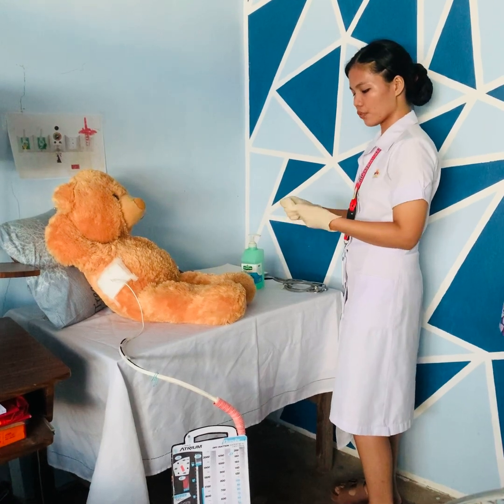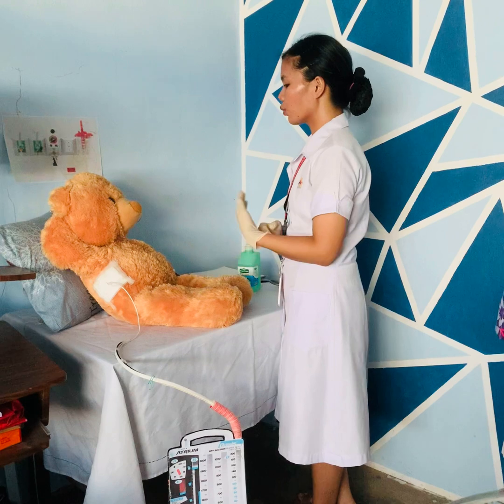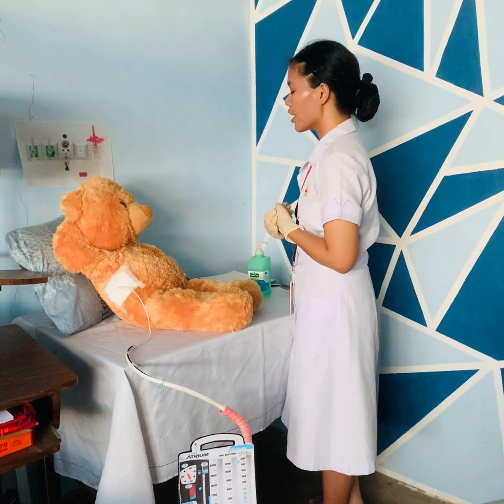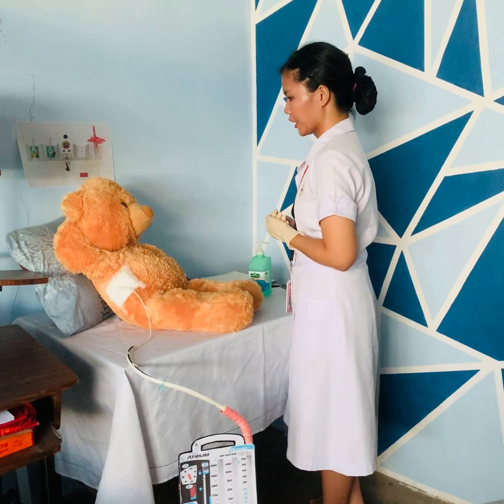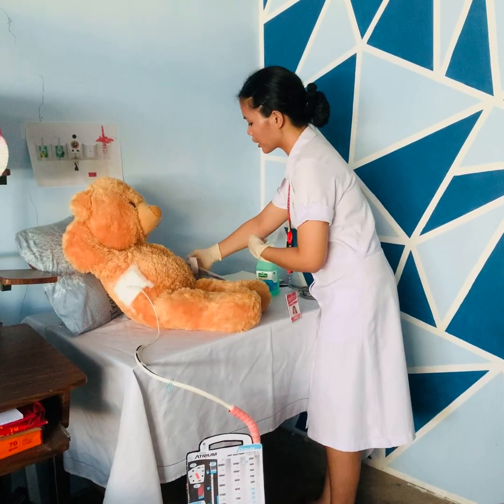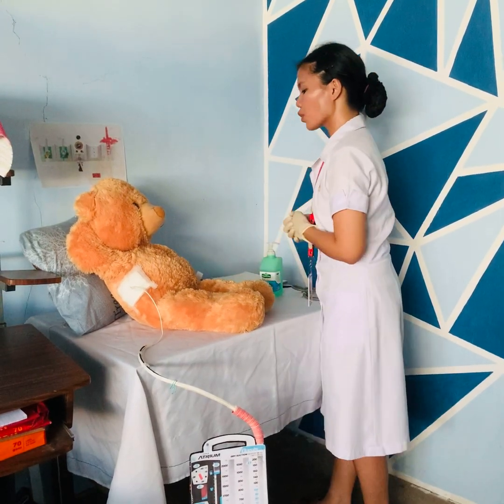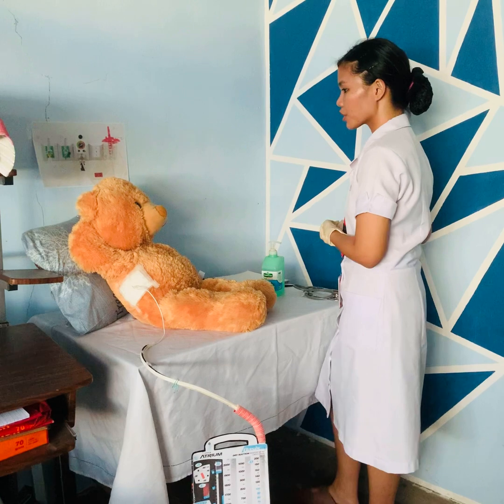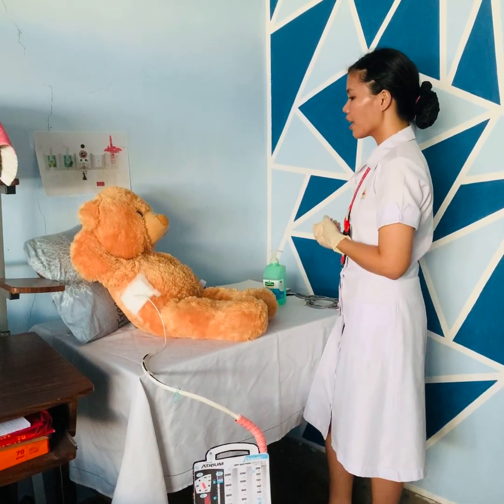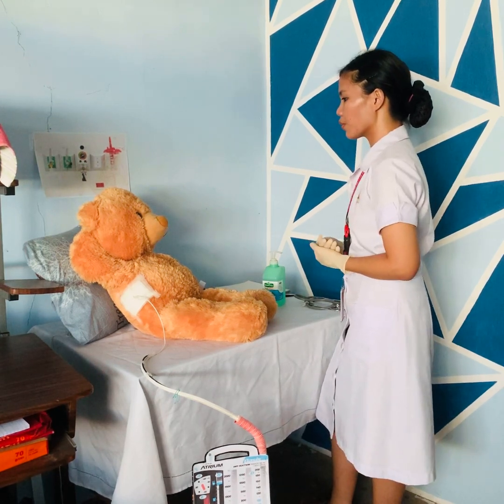Identify and introduce yourself to the patient. Okay, hello sir, I'm Jermyn Ann Marquez. I will be your nurse for the day. May I know your name and date of birth, sir? So now sir, I'm here to check and assess your chest tube insertion site and also the drainage system. Is that okay with you, sir?